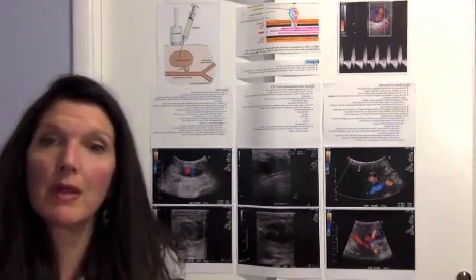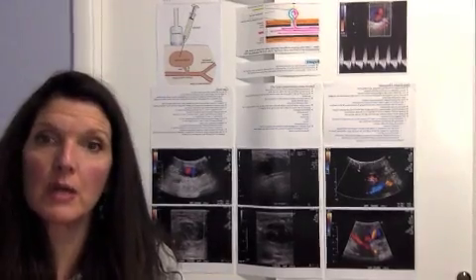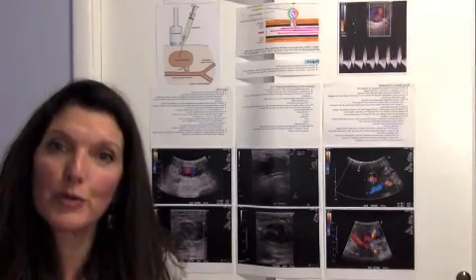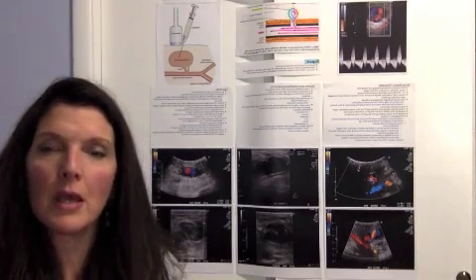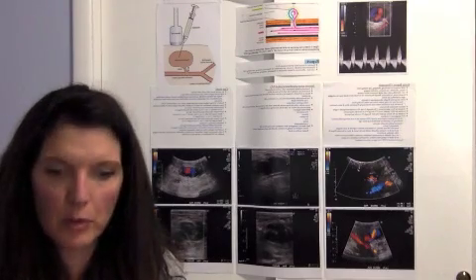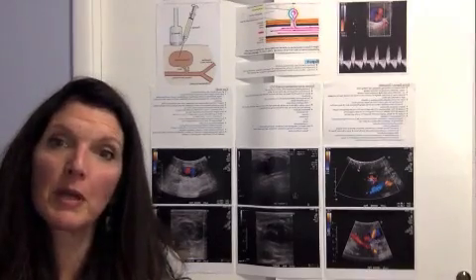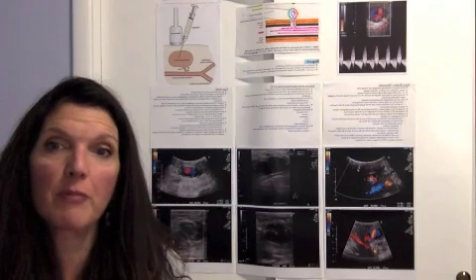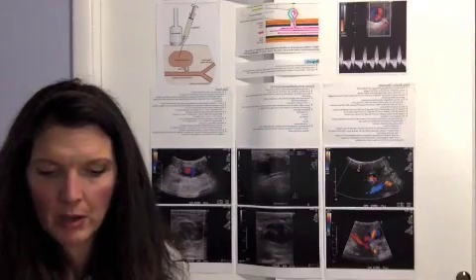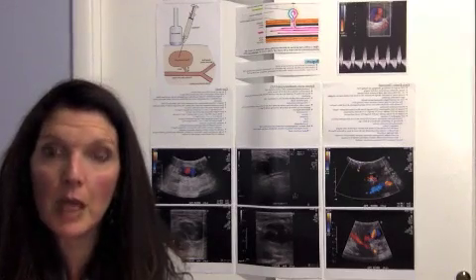Following a procedure like a catheter procedure, ultrasound can also be used to treat a pseudoaneurysm that is found by using the ultrasound probe as a compression. In this case, you want to push with the probe on the neck of the pseudoaneurysm. This method has been around for a while and typically can be successful in 75% of the cases, as long as the patient isn't on anticoagulants or the pseudoaneurysm isn't too big.